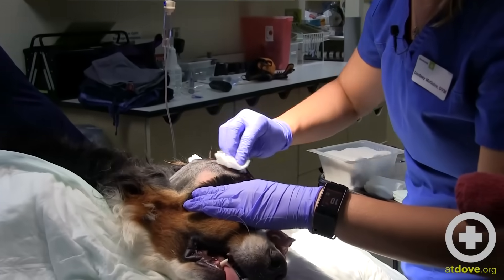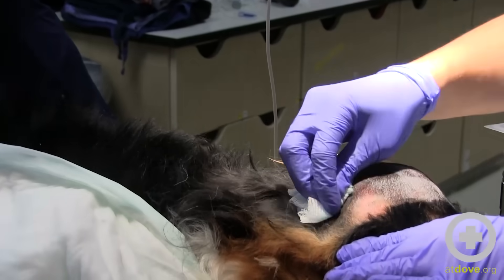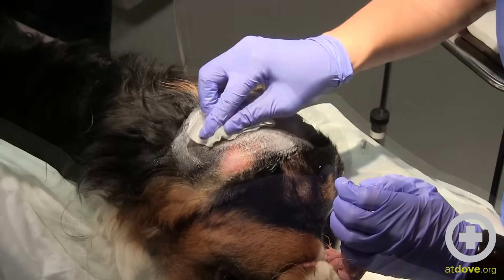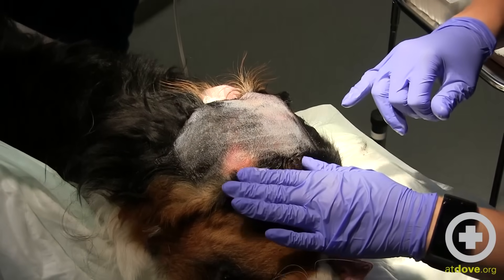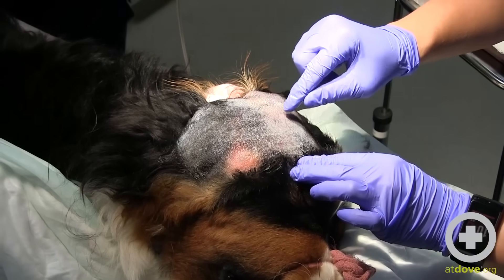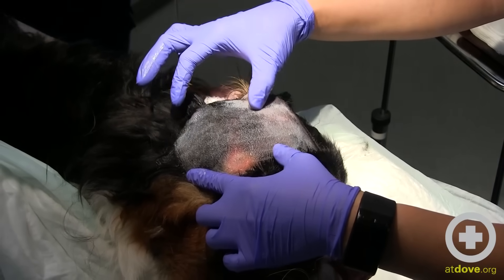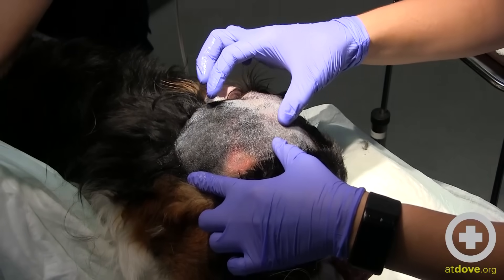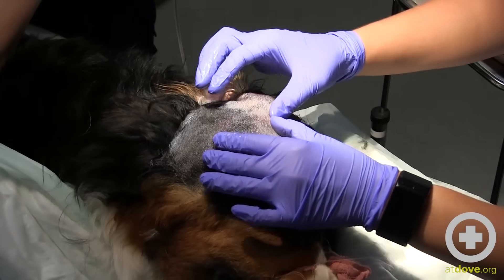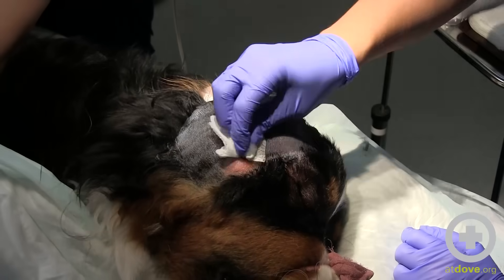We're going to start with a routine sterile prep of the area. There's a little area that looks like maybe a healed bite wound — we did aspirate initially in that region — and there's also a red mark further down. When looking for where to start the incision for drainage, you're feeling for the softest, most fluctuant, squishy part. This area is pretty firm down here, but softens up over the top of her forehead, and since that's where there appears to have been a wound, that's probably where we'll start with our drainage.